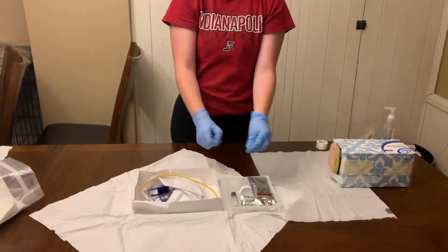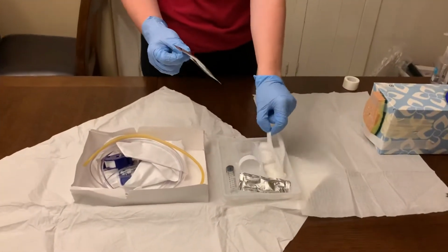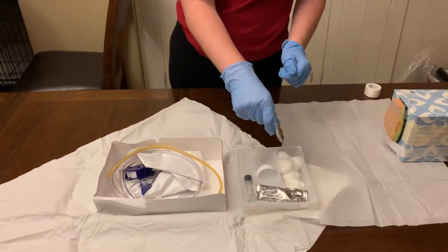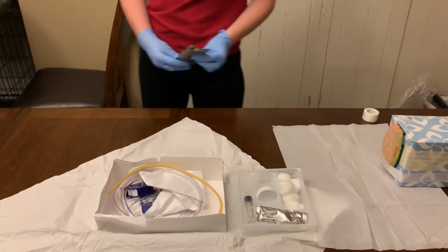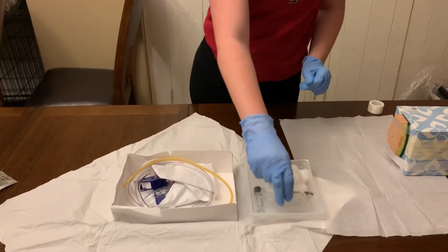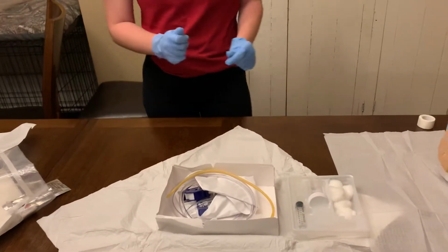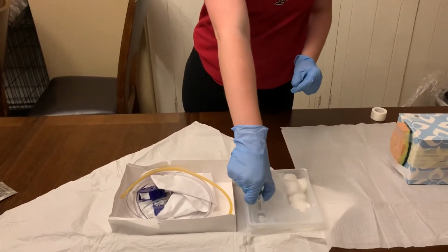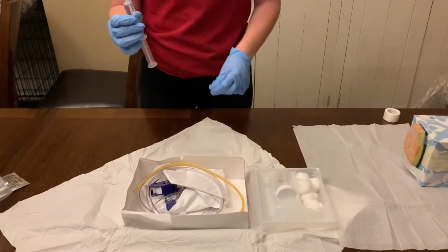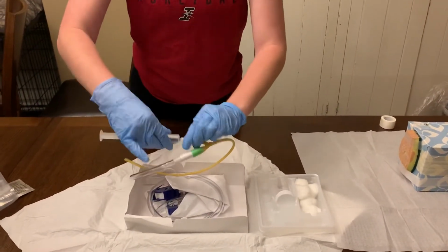I'm going to take my tray, and I'm going to first take out my forceps. I'm going to set these on the sterile field, just out of my way a little bit. And I'm going to squeeze my antiseptic solution onto my cotton balls, and then I will throw that away. I will take my lubricant and open that into the tray and discard that as well. I will then take my syringe, take my cap off, and I will connect this to the proper placement on the catheter tubing.